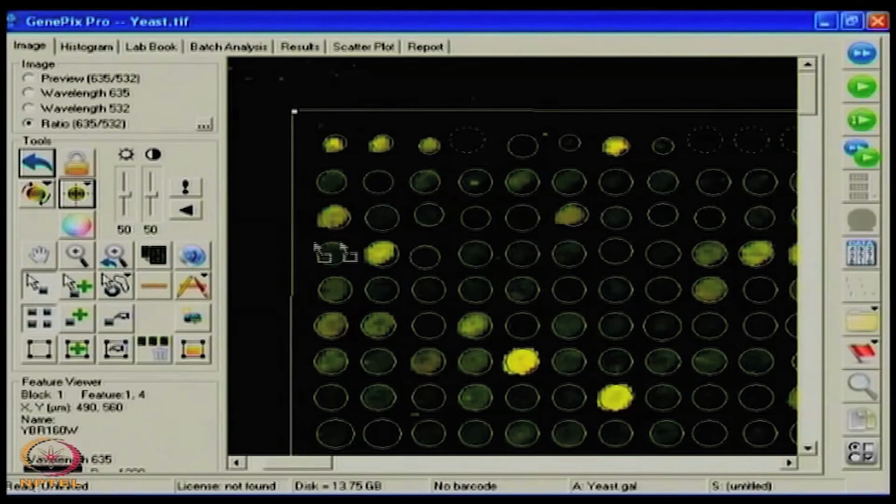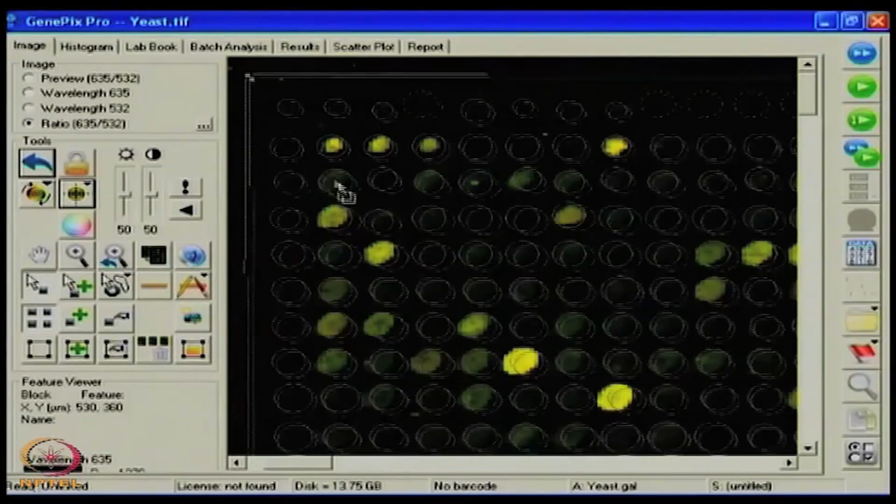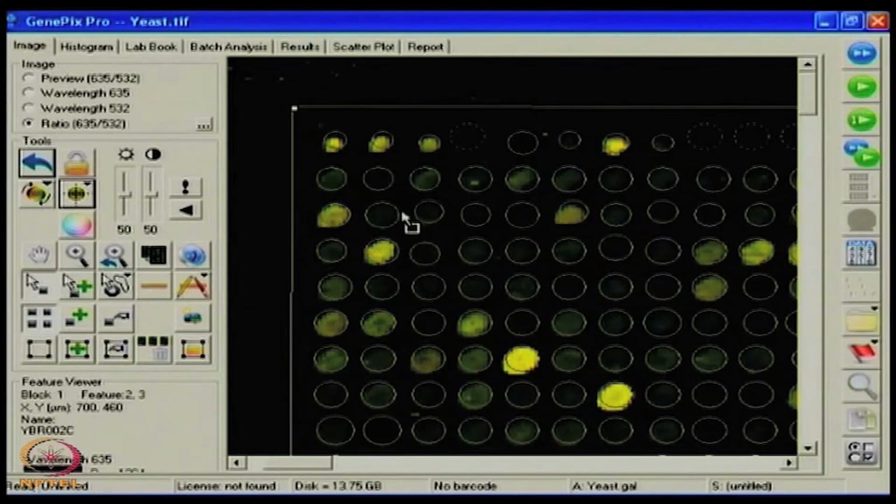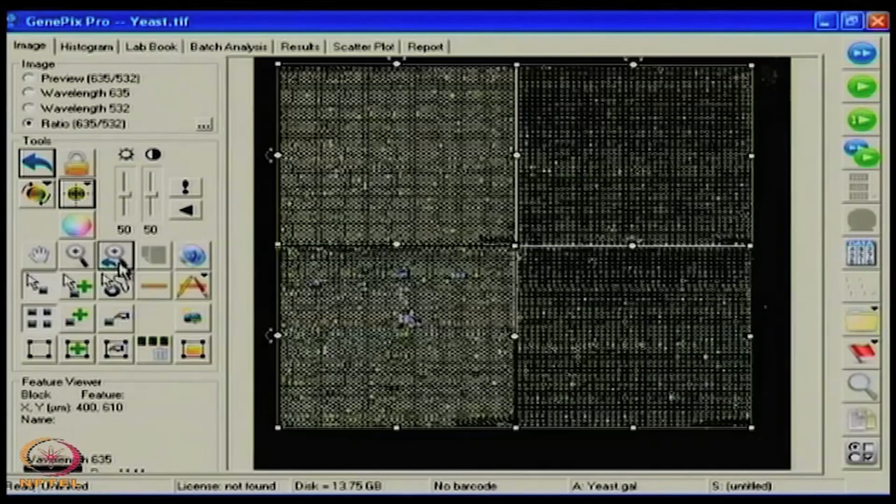As you see, you can actually move it, but it doesn't matter as long as you have clicked once and the data is being stored. But usually people ask me, is it a good idea to do it once again if I happen to move it? It's not a bad idea, because it takes only a few seconds. Once you have done this alignment, let's look at these two slides, which you can zoom out. You can see the whole slide is now scanned and aligned as well. It is a very quick process which the software performs very easily.